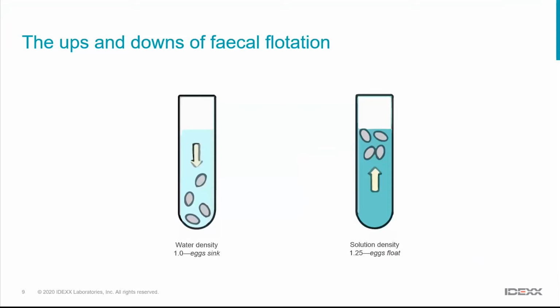I don't think it's a technique that most people enjoy. It's a little smelly, it's a little messy. The other thing to remember is that these solutions are pretty hard on your microscope as well. So you've got to make sure you clean the objectives with that. Otherwise, it's going to damage the microscope.